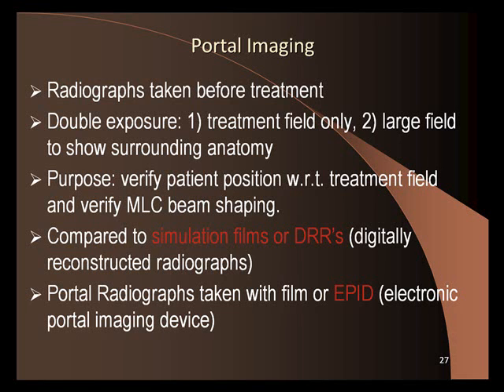Okay, the patient's not this close to the gantry. But anyway, the photons come down, and then you can take an image of the patient, and that image is relayed to a monitor outside on the treatment console. So this is for MV imaging. EPID is MV imaging for portal radiography.